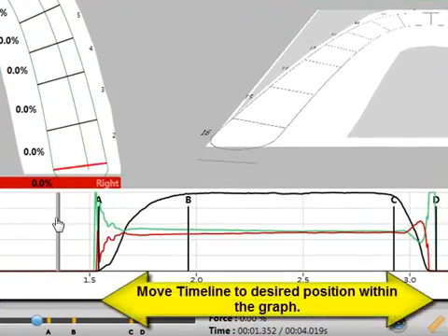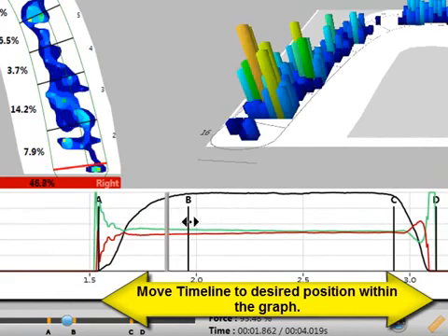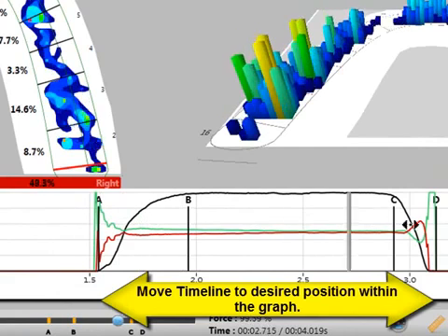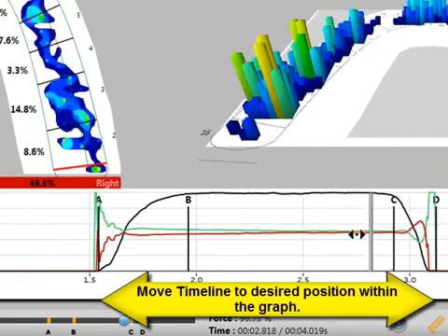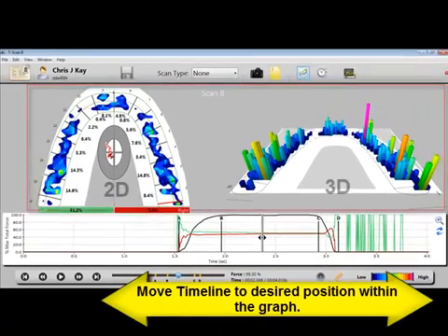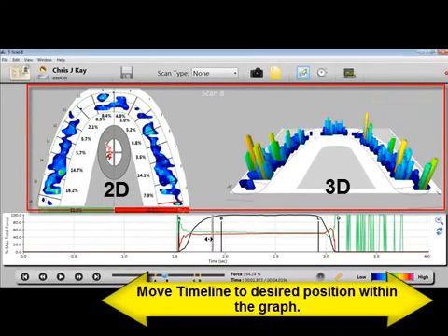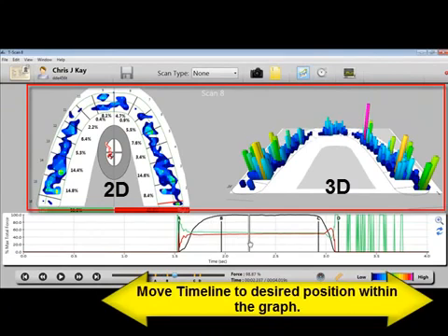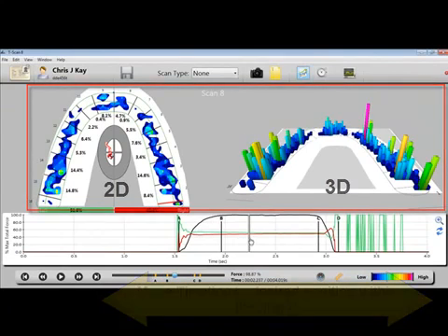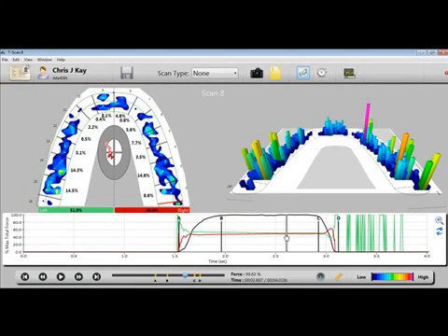To move the timeline, click the gray line and then drag and drop it to a new position in the graph. In addition, the 2D and 3D force views also update dynamically, depending on where the time indicator is located.